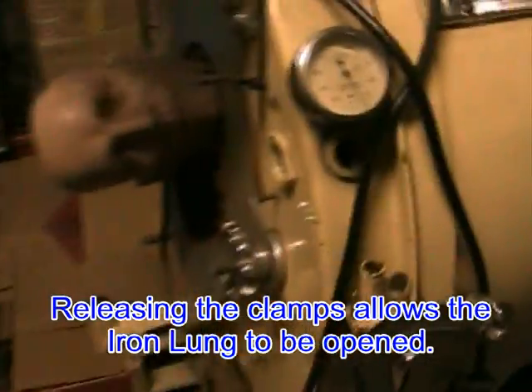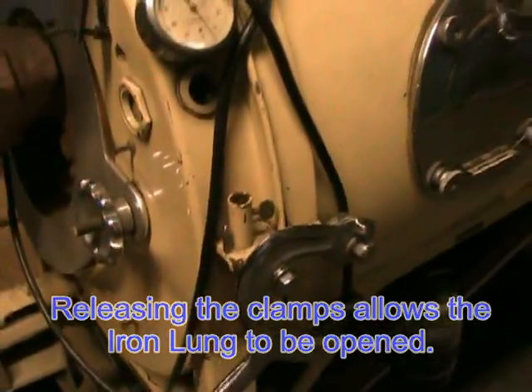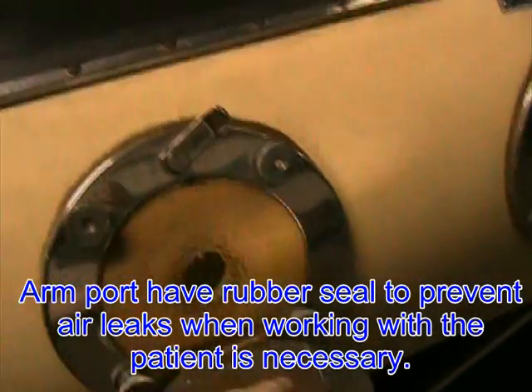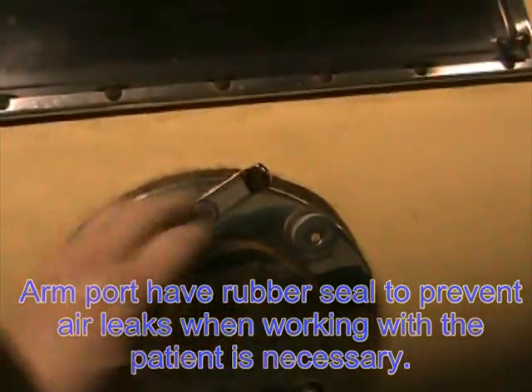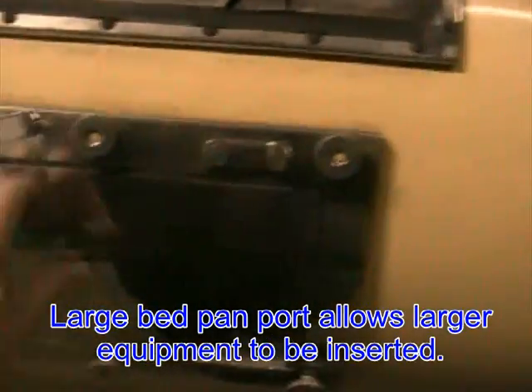Access into the iron lung is through these handles. We will open that up a little later. If you need to get to the patient, you have hand ports along the way, and you have a larger port for bedpans.